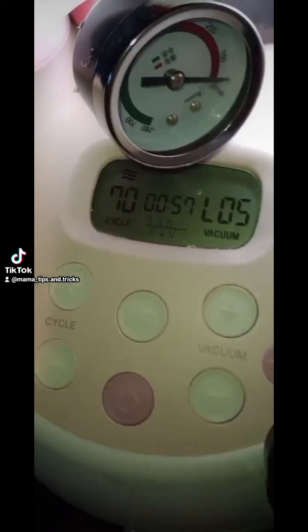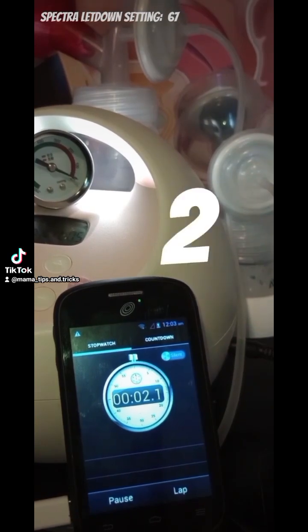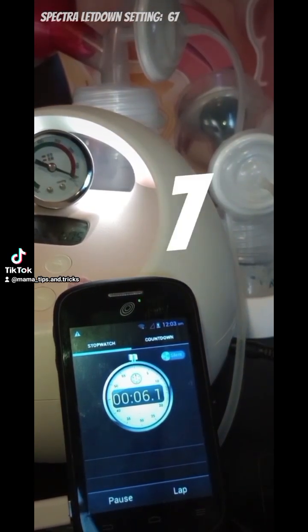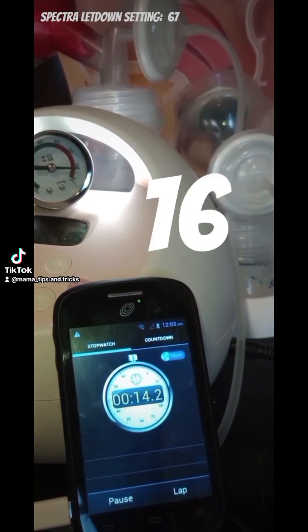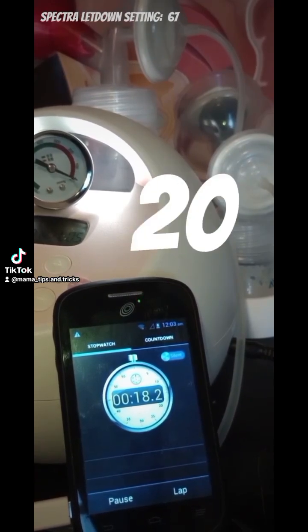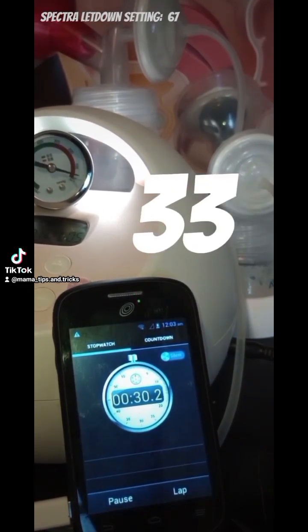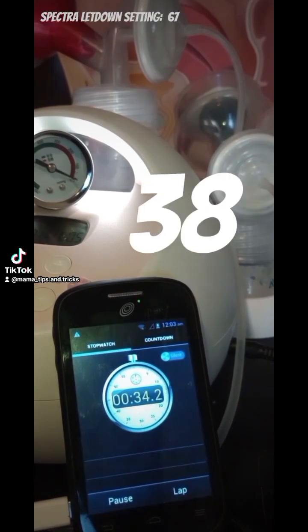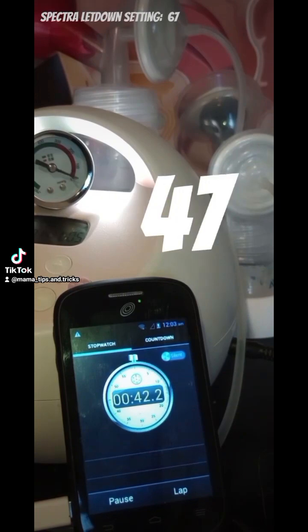So this video is specifically dedicated to the Spectra S2 versus the Medela Maxflow. There are some major differences between the Spectra and the Medela pumps, but this is one of the biggest ones. It is speed. So I am showing it in 2x speed just for the sake of this video. If you really wanted to, you could probably slow it down by half and watch it in real time. There's only one part of this video that is not sped up.